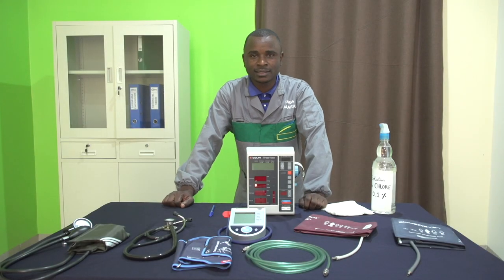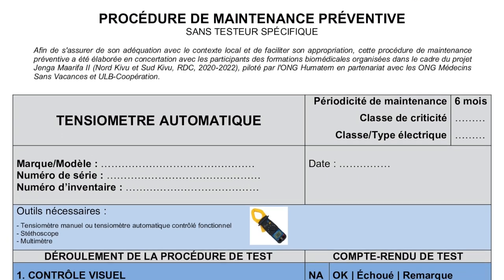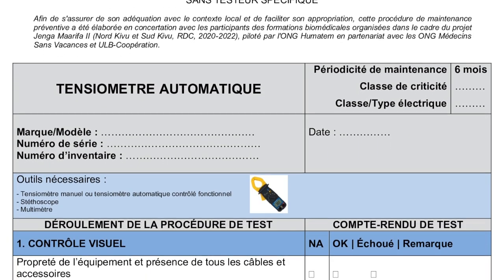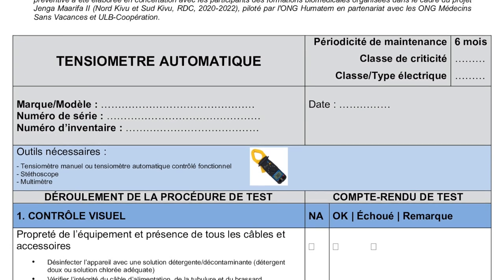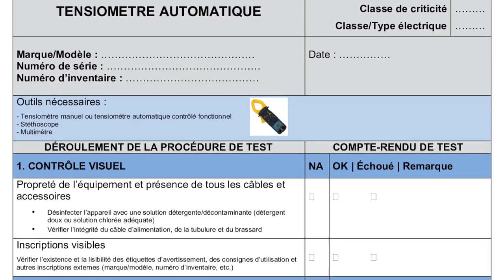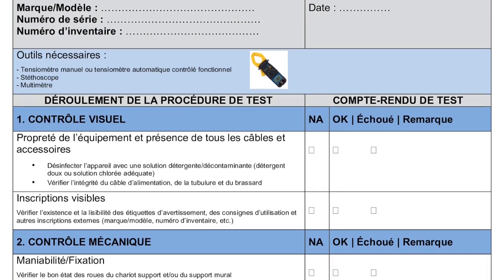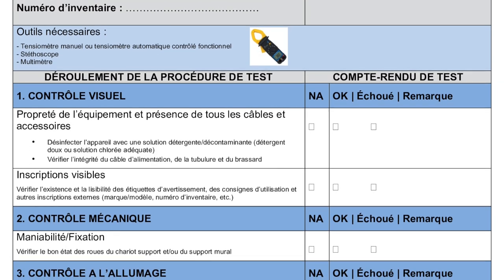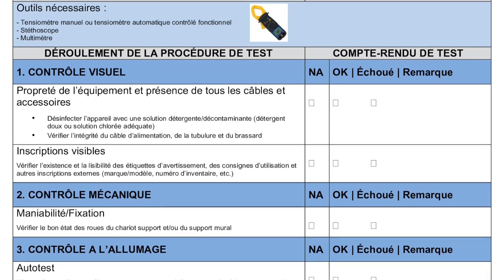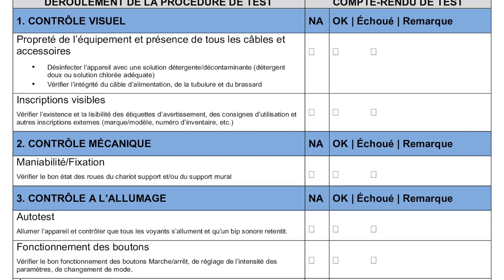Bonjour les amis, nous allons vous présenter une procédure simplifiée de maintenance préventive pour le tensiomètre automatique. Cette procédure ne nécessite pas l'utilisation des testeurs spécifiques et s'adapte à tout type de tensiomètre automatique. Par contre, elle nécessite soit un tensiomètre manuel et un stéthoscope, soit un autre tensiomètre automatique dont on est sûr du bon fonctionnement. Vous pouvez télécharger cette procédure via le lien sous la vidéo.